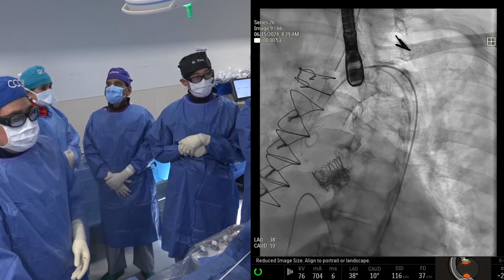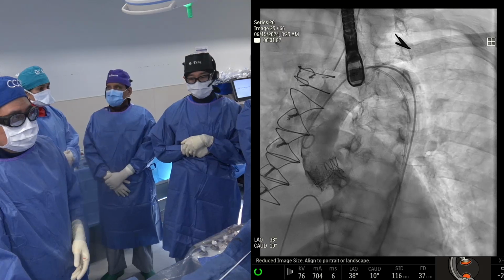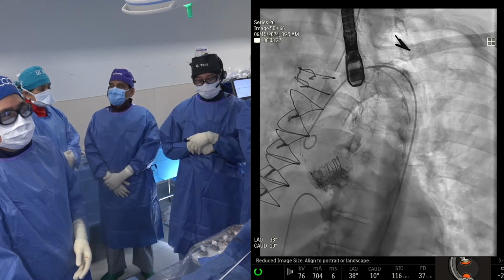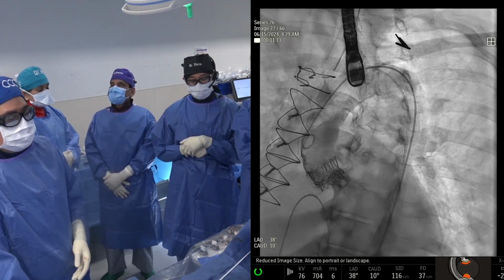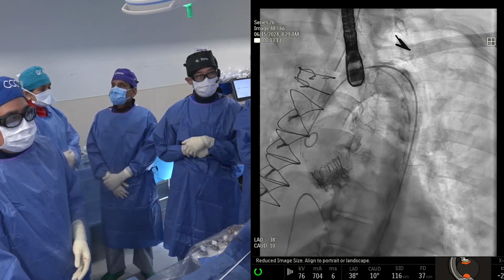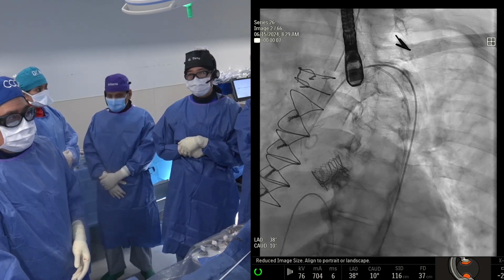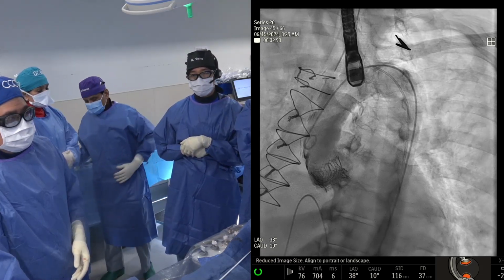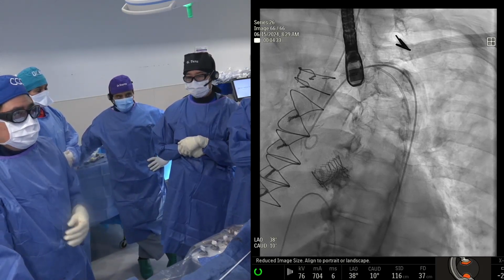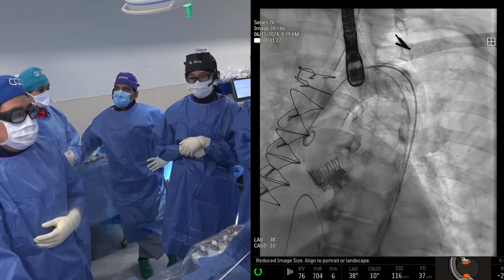Just to pass on your messages, because there are three sources of information coming in. On the pre-fracture issue, we've messaged the advantages and disadvantages of pre-fracture versus post. There's clearly one disadvantage you can't do away with: if you pre-fracture, you're committing yourself to valve fracture. We still don't know the consequences of valve fracture in the long term. Your second point is that it could create severe aortic regurgitation, severe enough to cause a collapse on the table. It's happened to some of us in our lifetime, and therefore, for me, valve predilatation is a no-no.